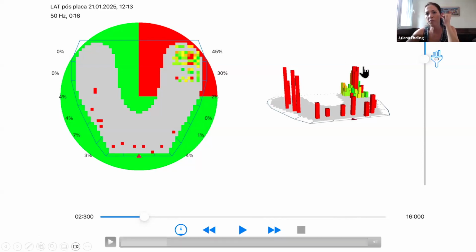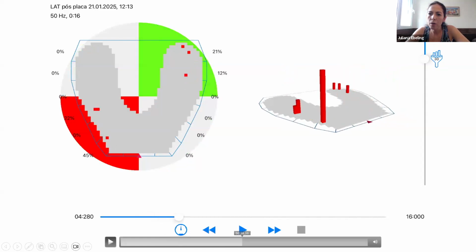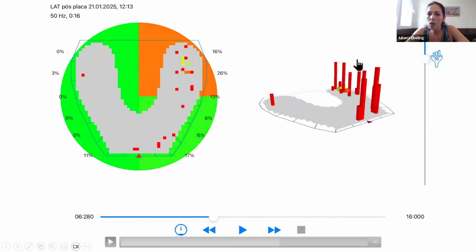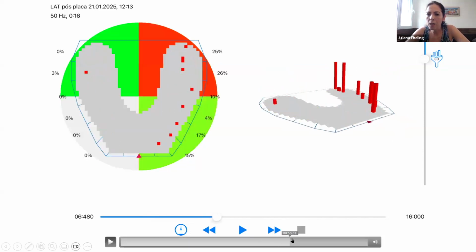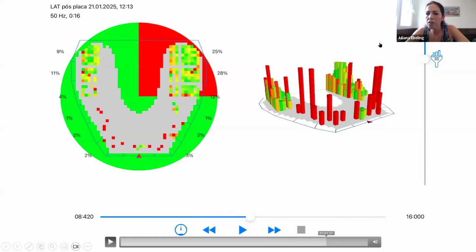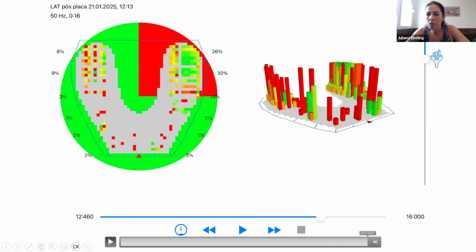And so this is very harmful for the system. And I can also have the number of the intensity of this contact. Look at that. And when I go back now to the right side, look that all the time we have the movements in group function for the left side, and the premolars are also included in this movement. This is the forward.